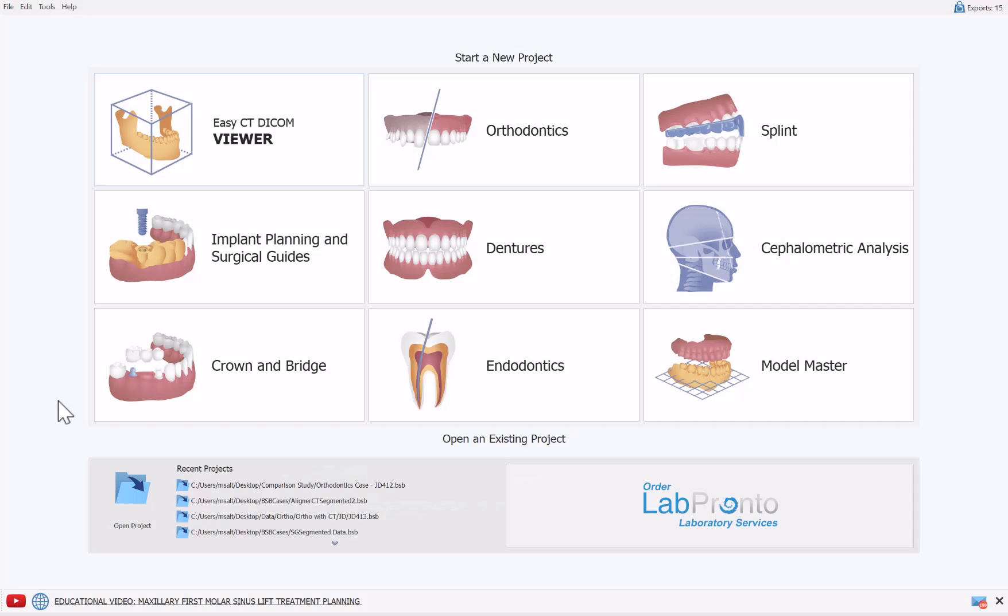This is Michael from BlueSkyBio, and in this tutorial, I will go through the orthodontics aligner process flow, emphasizing and focusing on new functionality that we're releasing as part of BlueSky Plan version 4.13.